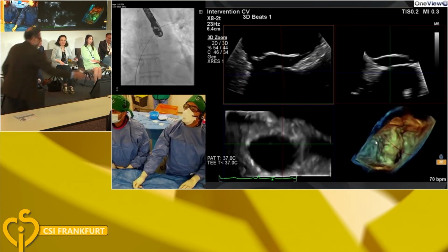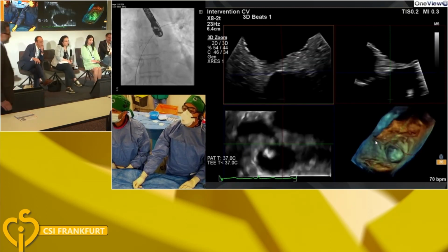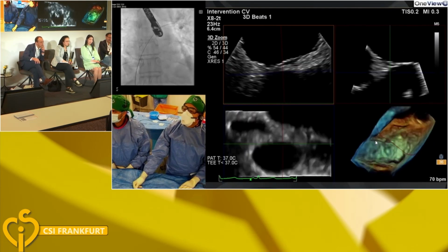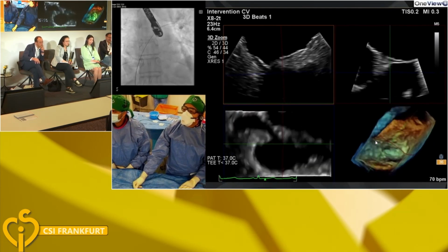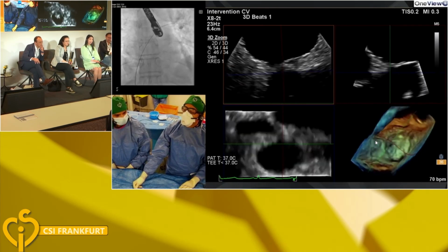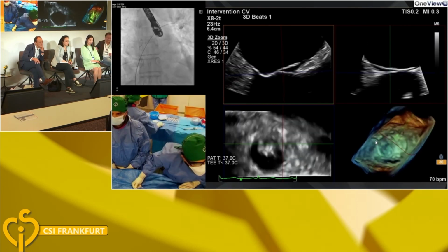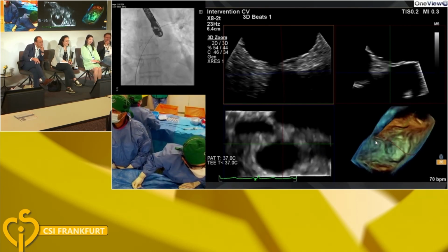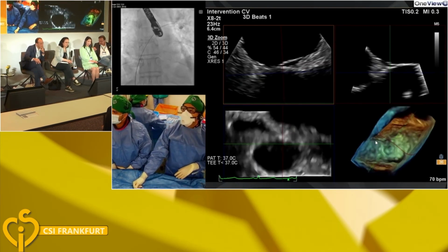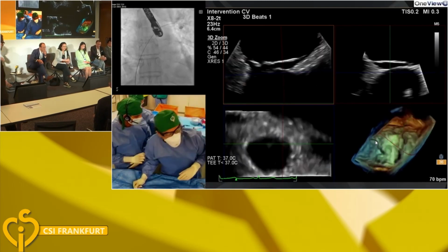Go for it. A couple of comments. I'm going to speak about the TEE perspective here in a little bit, but I would say the images are of such quality that even if we add a little color and we use multiplanar, we should be accurately sizing from the largest to the smallest. And then on top of it, I'm not an interventional cardiologist, so I'm not ballooning anyways. So I think the 3D color with the 3D information should be providing enough fiduciary information to really know what we're looking at. Thank you, Burkhard.